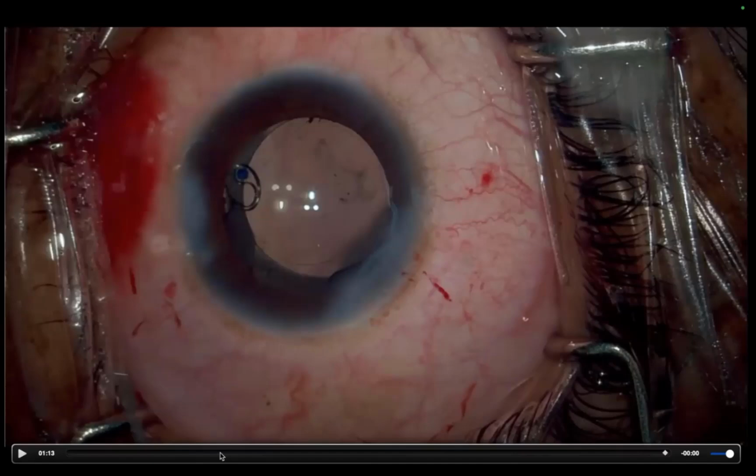We've tried these procedures where the zonules and the capsule are so strong on the other side that they fibrose over time and they rip. The CTS rips. The post-op picture is just like how you see in this. So I would not recommend doing this in gross congenital anomalies. If it is mild subluxation, it is fine.